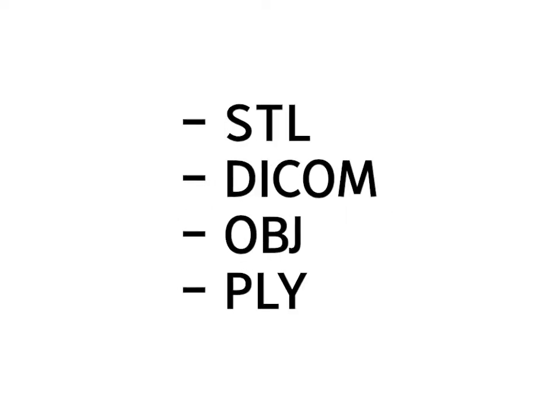The best known and most commonly used within the field of dentistry is the STL file, which may be very familiar to you. In fact, this kind of file was created by the company 3D Systems, and the acronym stands for stereolithography, or standard triangle or standard tessellation language. This type of file stores information regarding the geometry of the given 3D object, but it does not include information regarding texture or shade. For this reason, this file is not excessively popular beyond the field of dentistry.